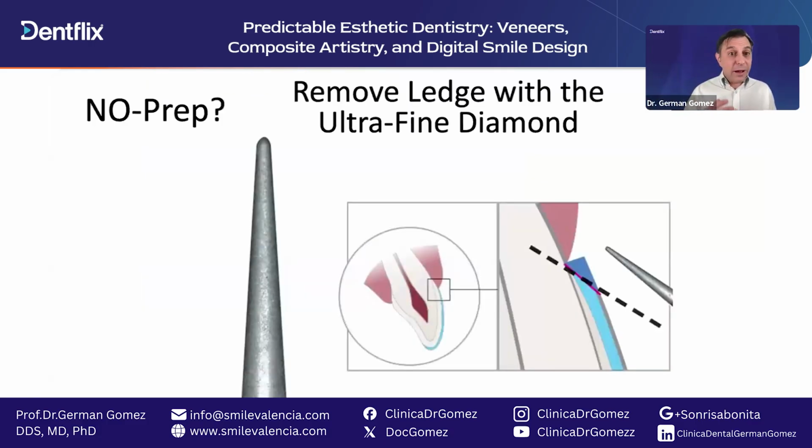Good. And we have to take into consideration that the veneer then is on top of the tooth. That means there is a margin near the gingiva and a step near the gingiva, and everything will be stuck here. So we have to take that away.